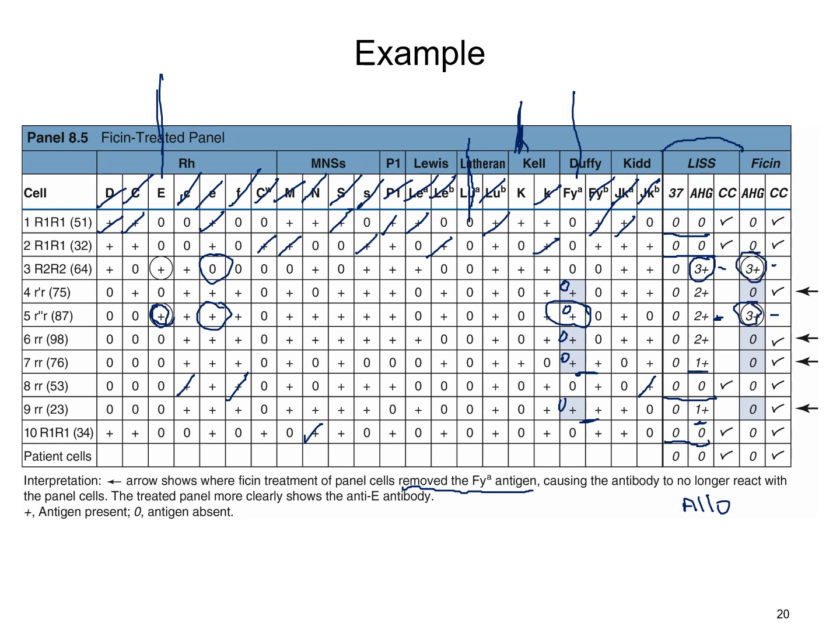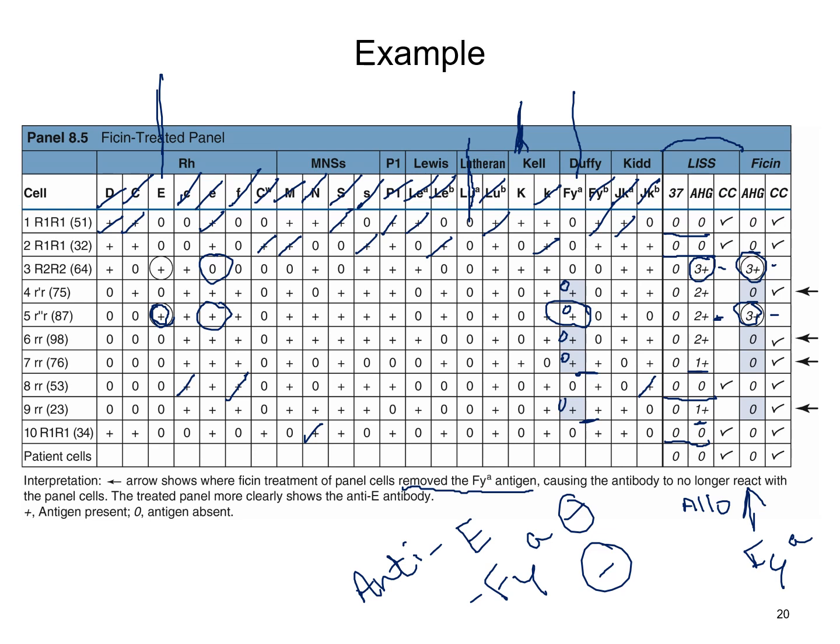So if you were to do your rule out now based off of these reactions, again, you've got to remember you've removed those Duffy antigens. So this basically helped you confirm and rule in the fact that you do have a Duffy A antibody present. Now our next step from here is antigen typing using our reagents of anti-E and anti-Duffy A. And what should our patient be, assuming they've not had any transfusions? They should be antigen negative for both of those.